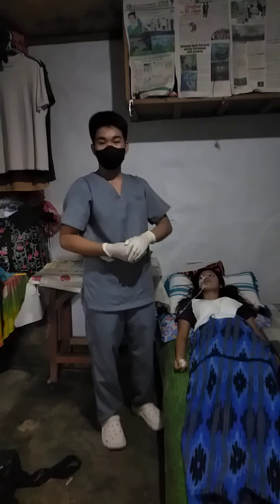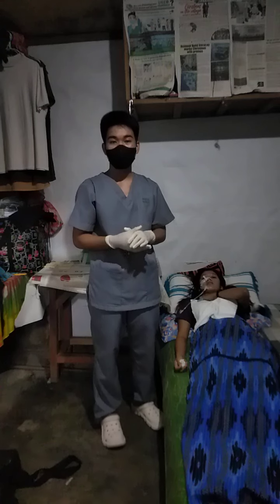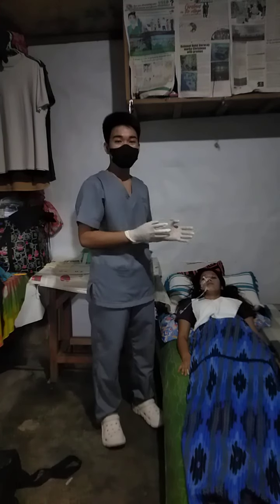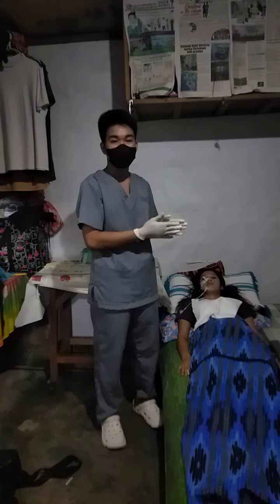Then measure the length of the exposed tube. Reinforce the marking on the tube at the nostril with indelible ink. Ask the patient to turn the head to the side opposite the nostril in which the tube is inserted.